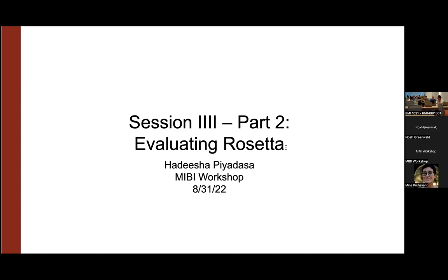And Hadeesha is going to talk about that here, but everything else should be constant in principle across all the sites. Now, obviously, if people come back after using this and say it's not working, then we'll revisit it. But everything that we've seen so far, and also from a first principle standpoint, says that really the only variability could potentially be the magnitude of compensation for the organics with the noodle channel.